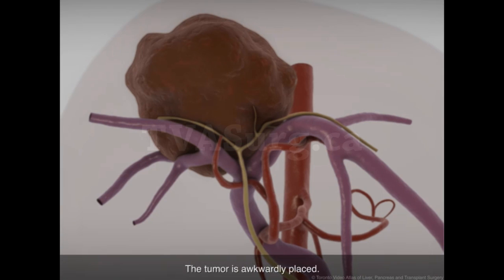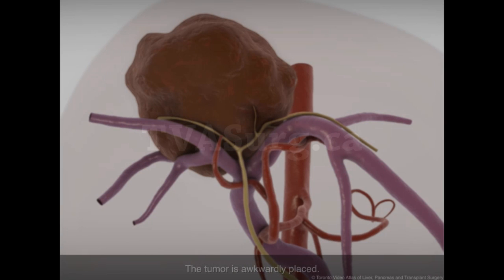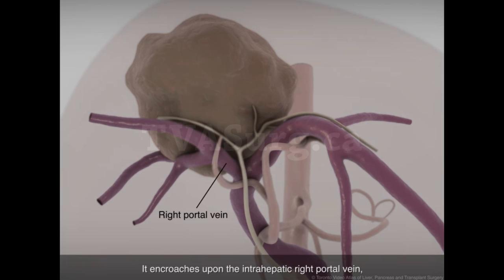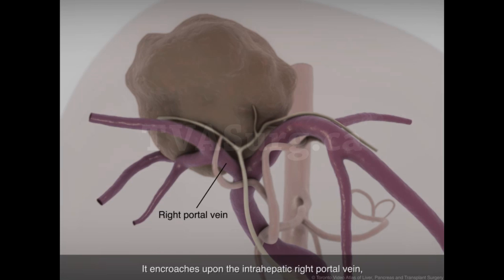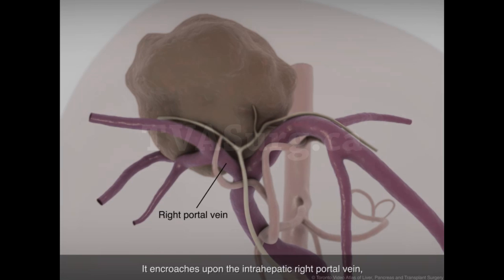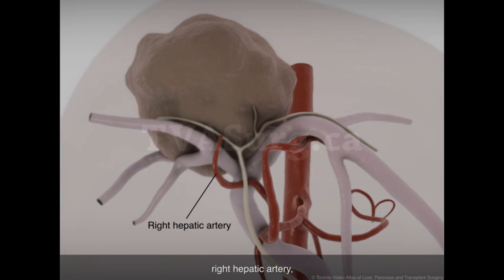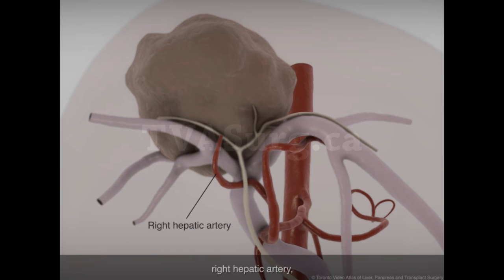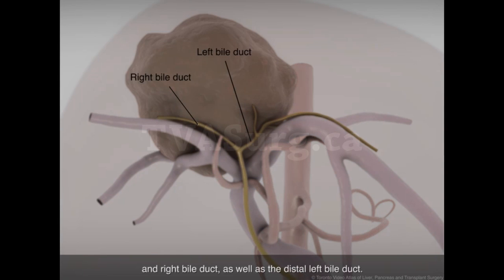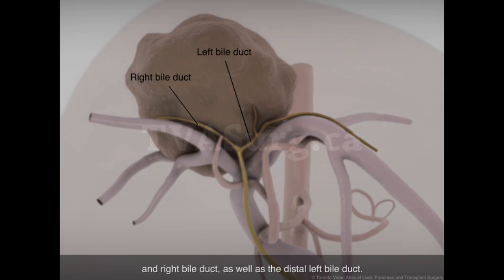The tumor is awkwardly placed. It encroaches upon the intrahepatic right portal vein, right hepatic artery, and right bile duct, as well as the distal left bile duct.